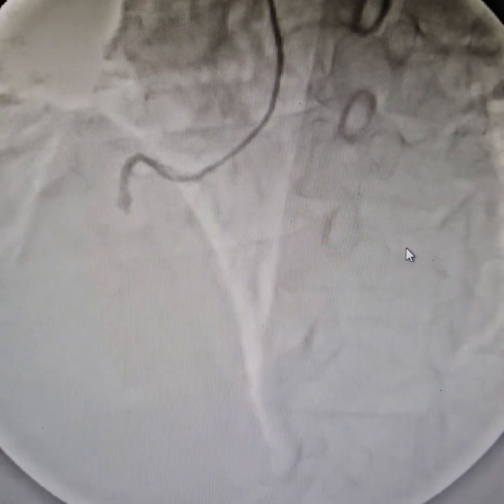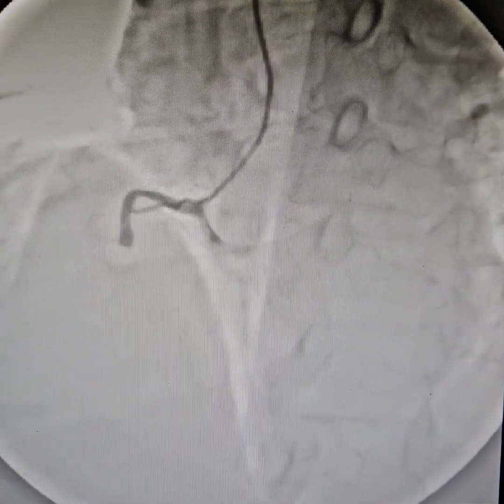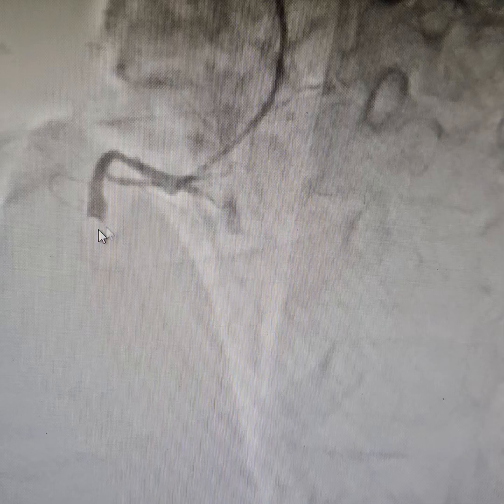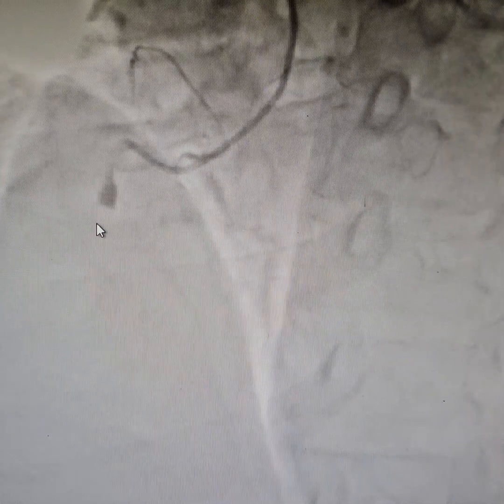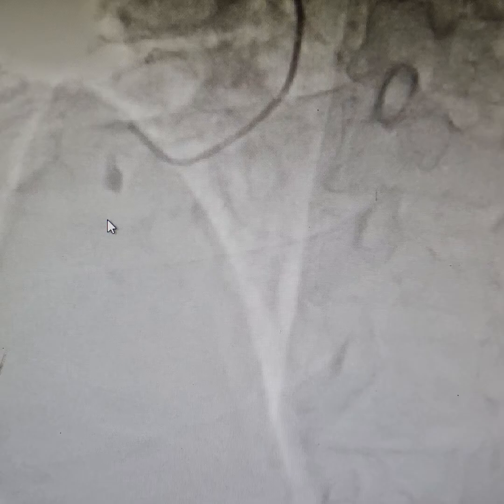As you can see, this is a 100% blocked RCA. It is an ectatic vessel that you can see here. There is a 100% blunt thrombotic occlusion of the RCA. The patient was in severe pain with sweating.